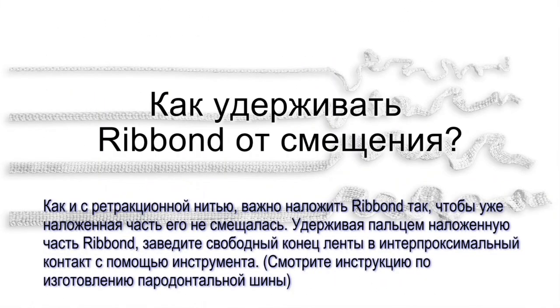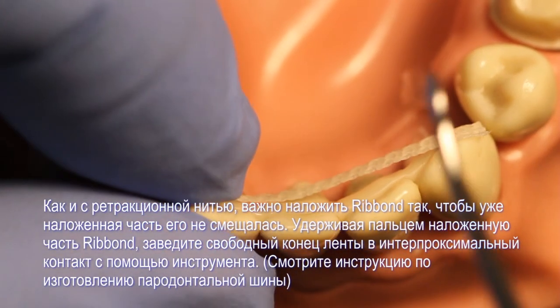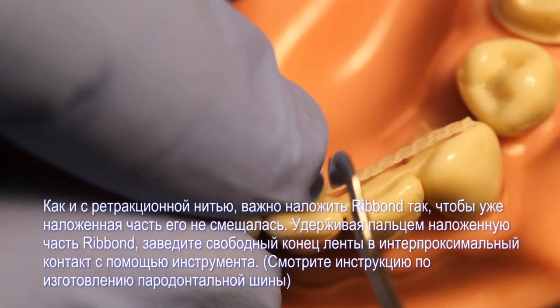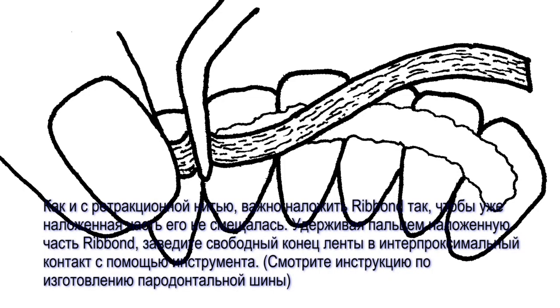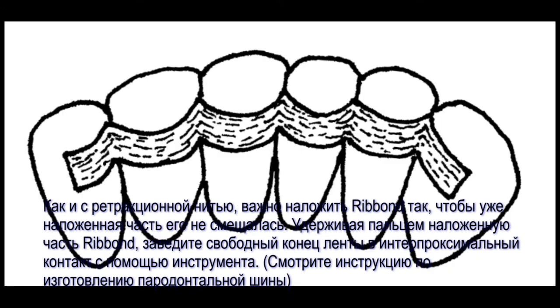When I use Ribbond, it moves out of place when I adapt it. Like packing retraction cords, it is important to adapt the Ribbond without displacing the Ribbond that has already been placed into the composite resin. While holding the adapted piece of Ribbond against the tooth with your finger, place the unadapted Ribbond into the interproximal contact with an instrument. This is shown well in the instructions for making a periodontal splint.